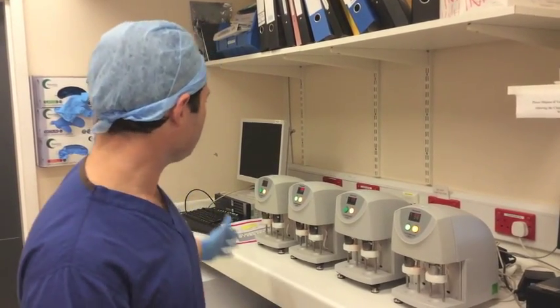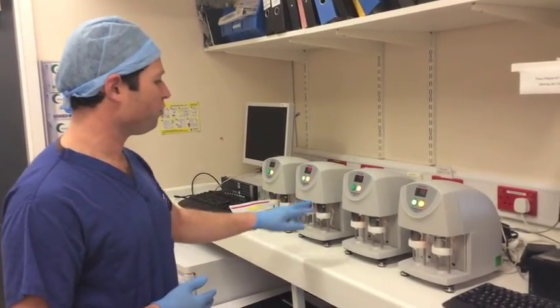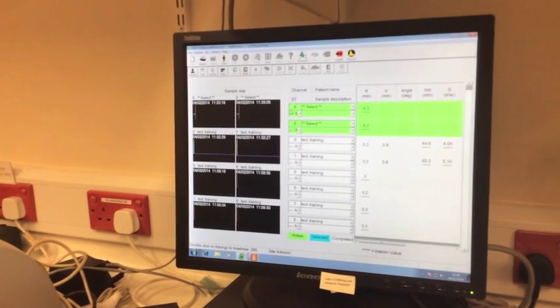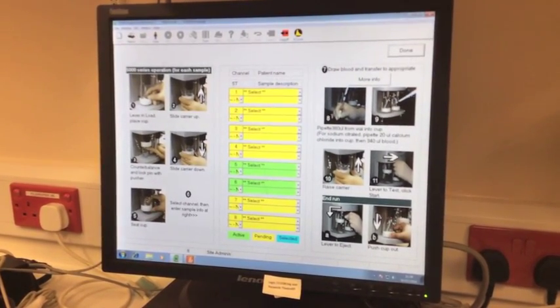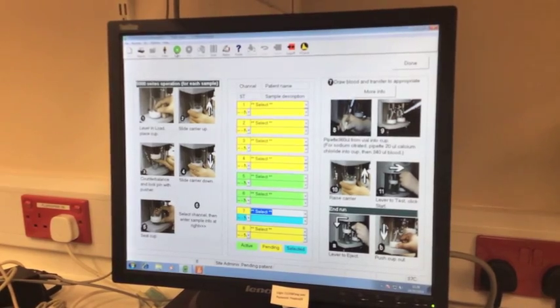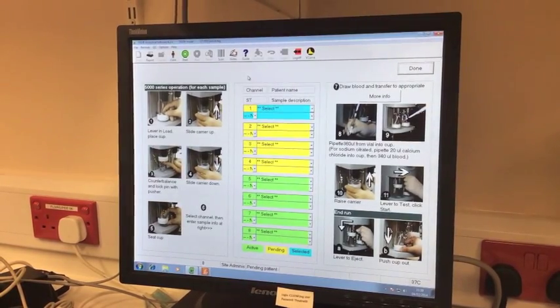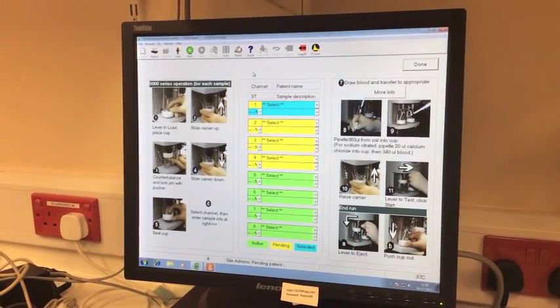What we need to do is start our trace. As you can see, here we've got four different analysers, each with two channels — so channels 1, 2, 3, 4, 5, 6, 7, 8. We're using channels 7 and 8, so we need to select those channels. Sometimes we'll be on our results screen; to get to the home screen in order to start the samples, we need to press the TEG button. Once we get to this screen, we're then going to select the channels we want — we're running 7 and 8. We select channel 7 and press Start, then select channel 8 — it goes blue, which means it's selected — and press Start. This means that the analysis of the samples is beginning and that we're recording the traces that are developing as the blood clots.